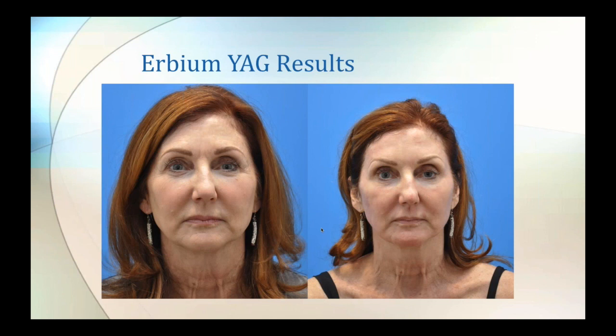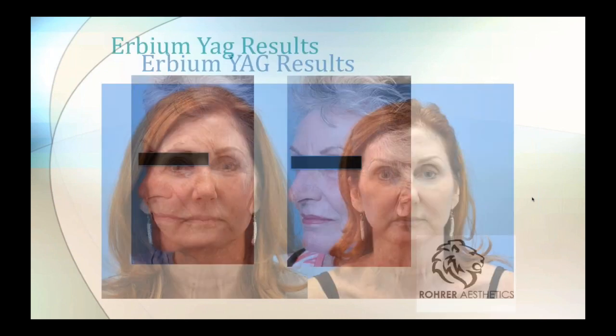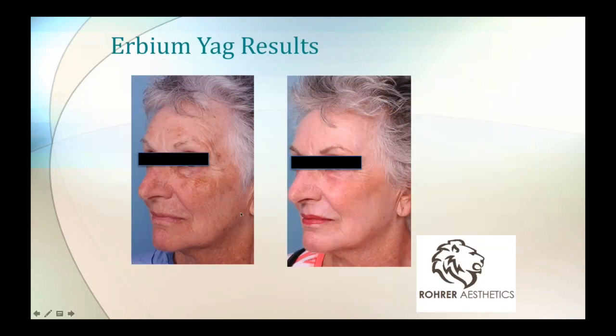These are very realistic results here. If you look at this, the technique here is pretty good in terms of photographic technique. These are real results. And what you see on this patient is a fairly good resolution of some of the periorbital wrinkles, as well as some smoothing of the skin, a little bit of overall tightening. Once again, not what you get on a CO2, but you'll save the downtime, and this is very, very good on the younger patient. This is why I like erbium for this kind of patient.